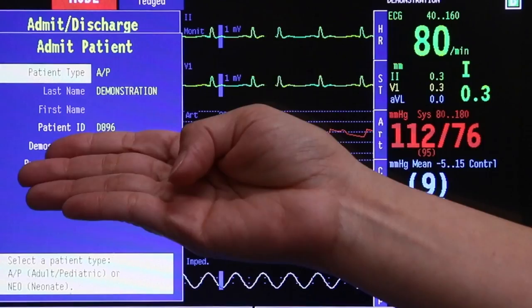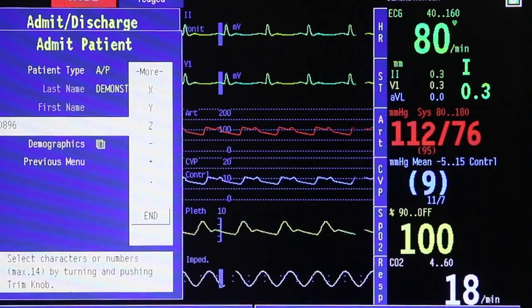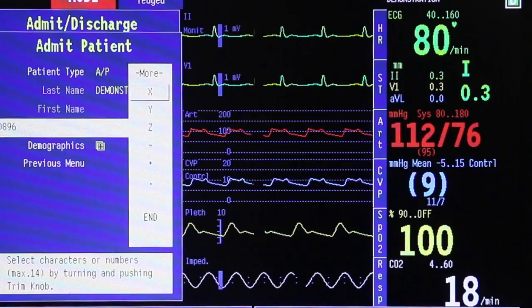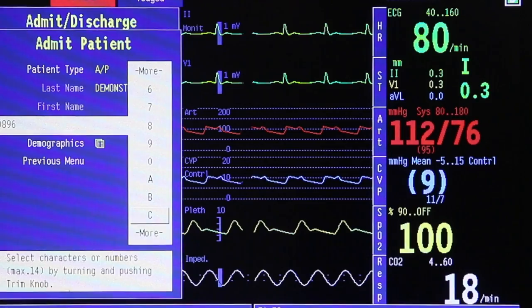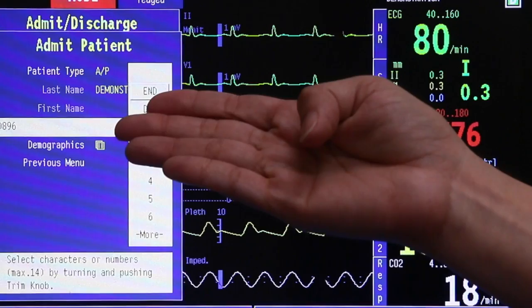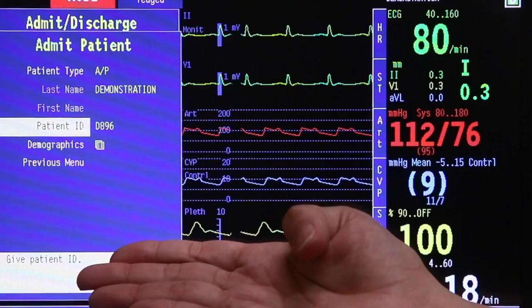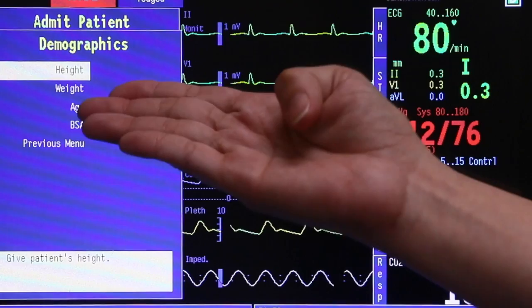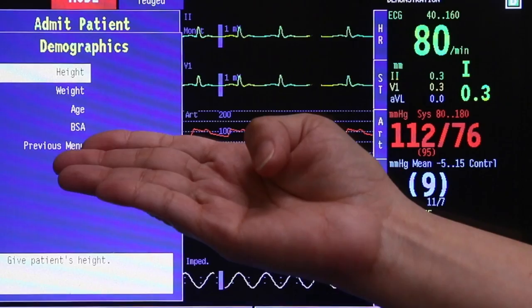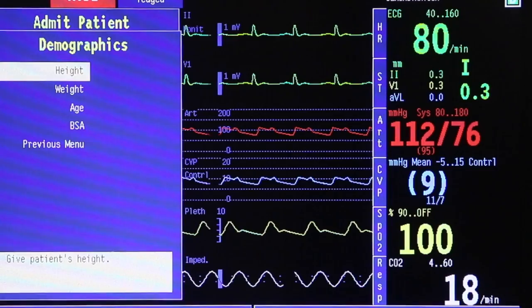Next, scroll down to key in the last name, the first name, and the patient ID of your patient. Rotate the trim knob and press once to enter. You can scroll left or right to choose numerics or the alphabet. Once done, press N using the trim knob and it will bring you back to your previous screen. Next, you can key in the demographics of your patient — scroll and press once where you will see the height, weight, age, and body surface area of your patient. Once you have finished keying all that data, press previous menu.